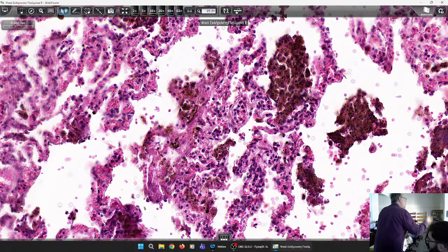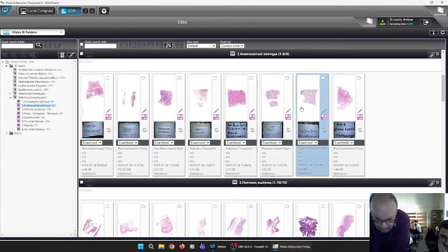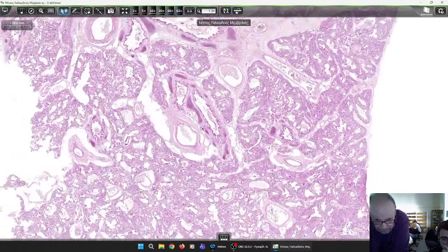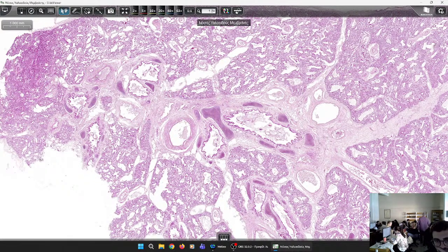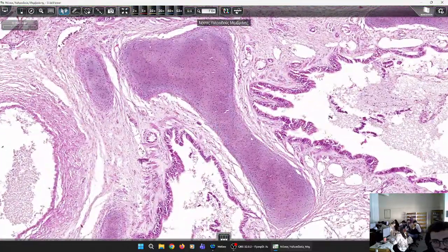And also another lesion that in the long term may lead to fibrosis is this one. The diffuse alveolar damage. Have a look at the slide. This slide, please open it in your electronic devices. What do we see here? We have the lung parenchyma. Please identify these structures that you see here. Which structures are there in the middle? And what do they have on their wall? Because they are large enough, so they contain this.